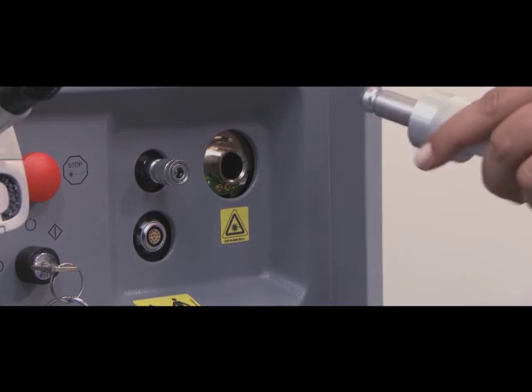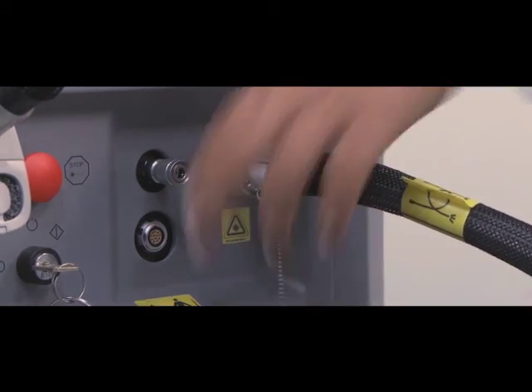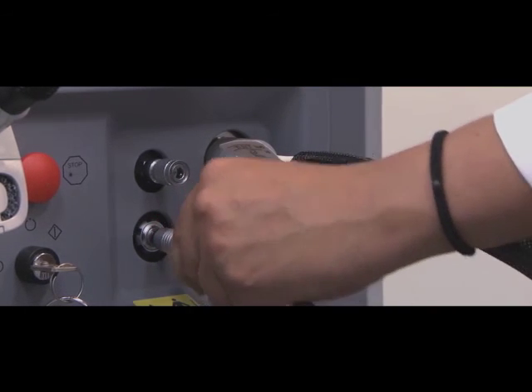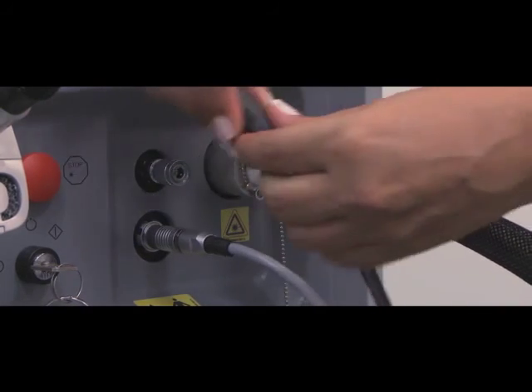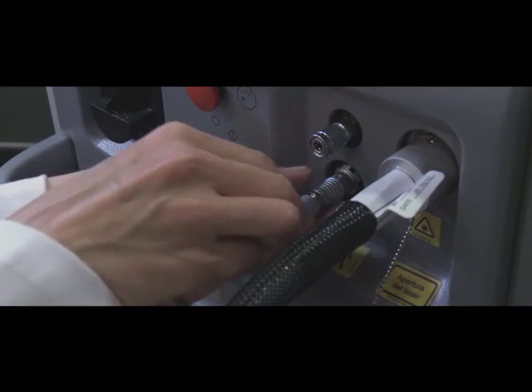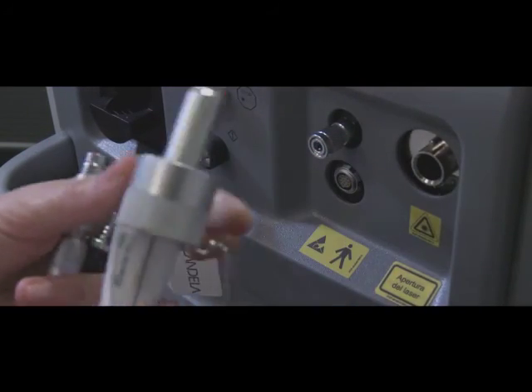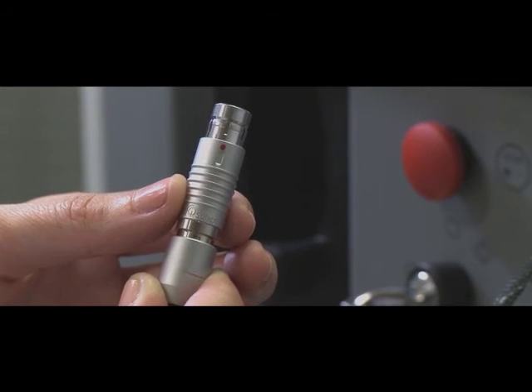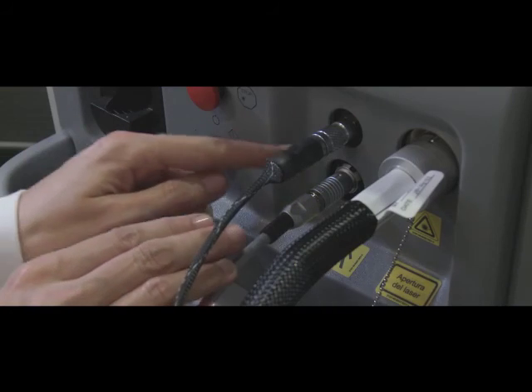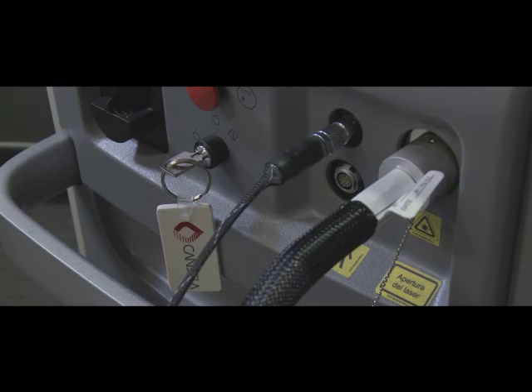When attaching the delivery system to the device, always attach the optical fiber first, lining it up and pushing. When detaching, release the fiber last by pulling back on the metal portion. To attach the electrical cord, line up the red dot to the red line. When detaching, simply pull back on the metal portion.